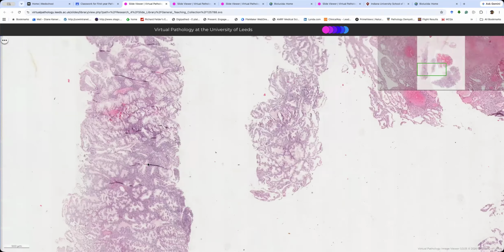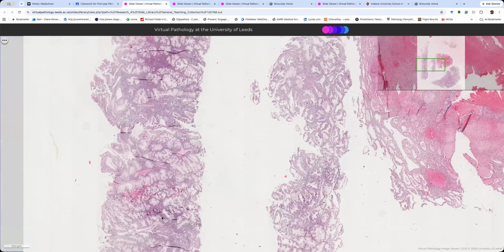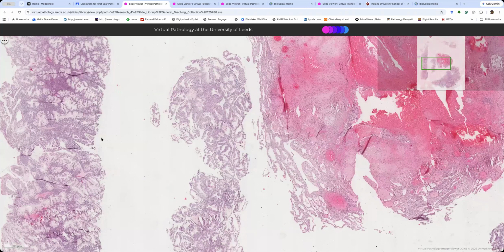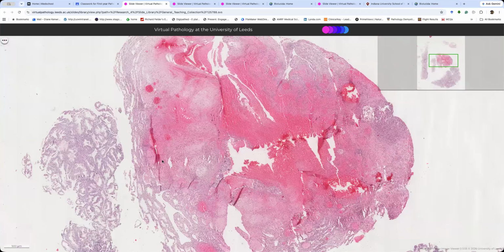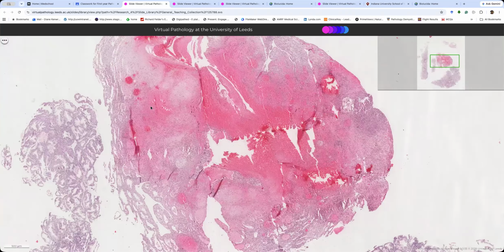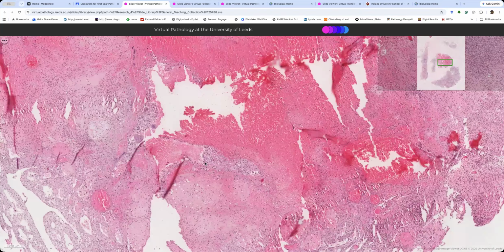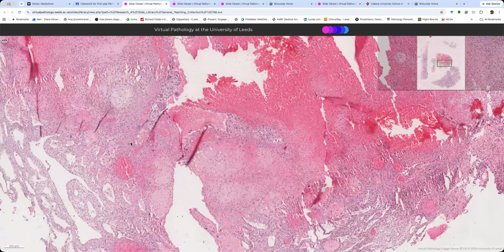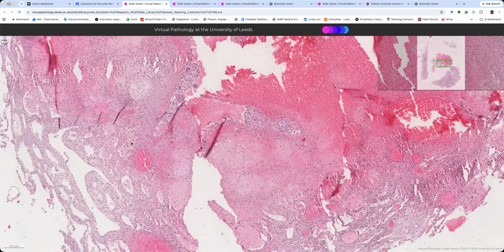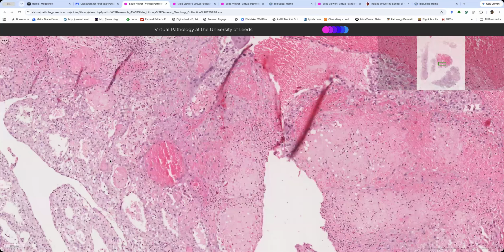What else do I need to tell you about this one? Over here. Okay, so this is the endometrium and this is the decidua. Okay, so here we are. We know she's been pregnant. We've got syncytial trophoblast and cytotrophoblast. It's either that or she's got a choriocarcinoma, but I'm betting on she's pregnant because we've got the hypersecretory stuff. And then we've got this decidualization around it.